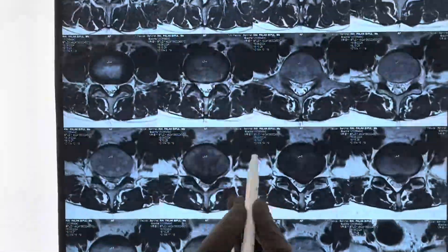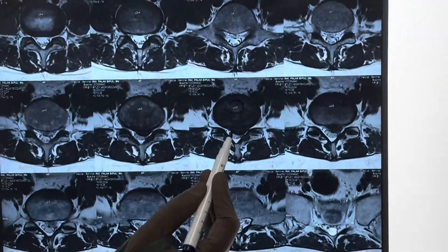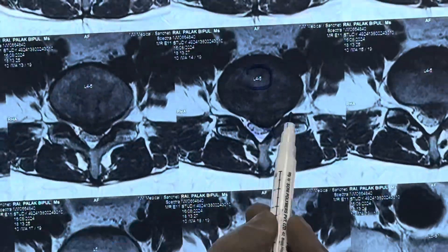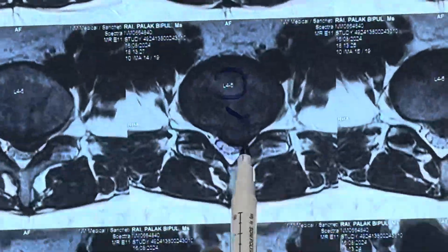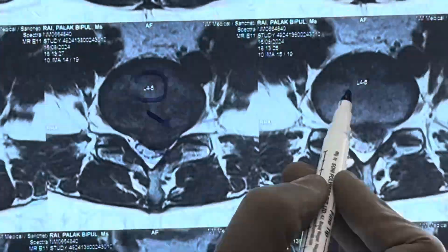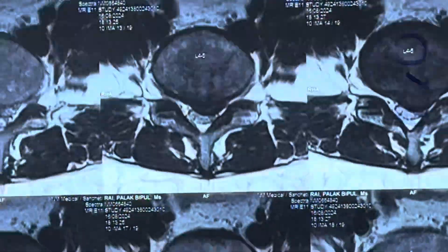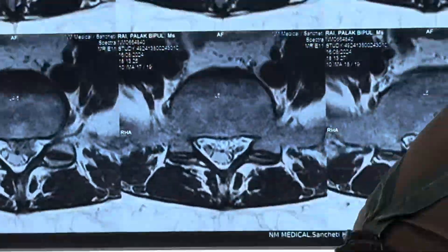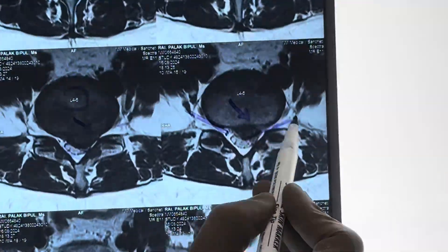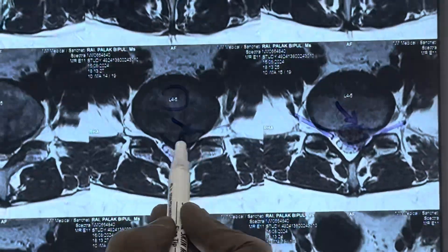If we see the axial images at the affected L4-5 level, you can see this is the thecal sac which is displaced, and this is the disc which has come out and it is pressing upon the L5 root supplying the left lower limb. The right root is going very freely but this left root is getting compressed by this disc.